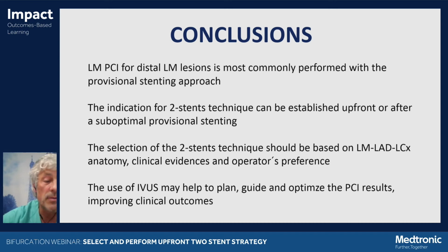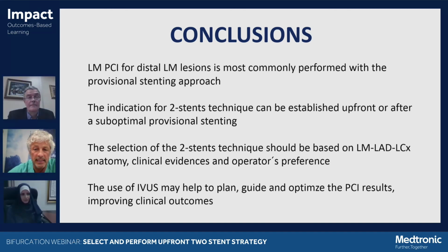The use of IVUS, some people prefer OCT. I prefer IVUS for left main, but OCT could be helpful. May help to plan, guide, and optimize the PCI results in this critical segment, which is the left main bifurcation, improving the clinical outcomes. Thank you.